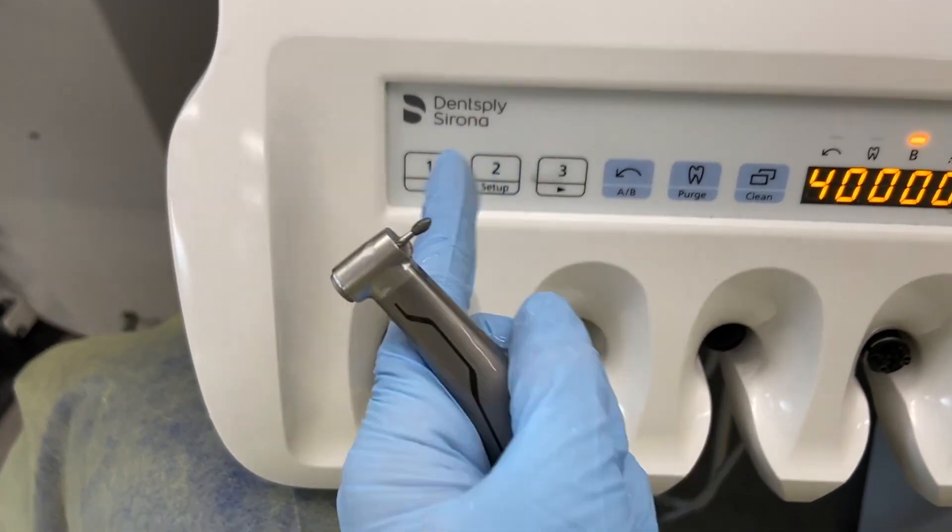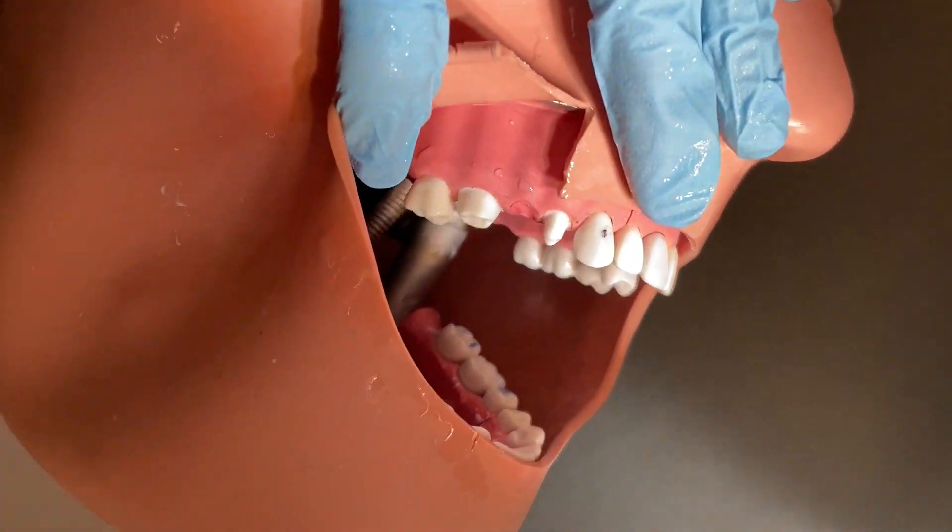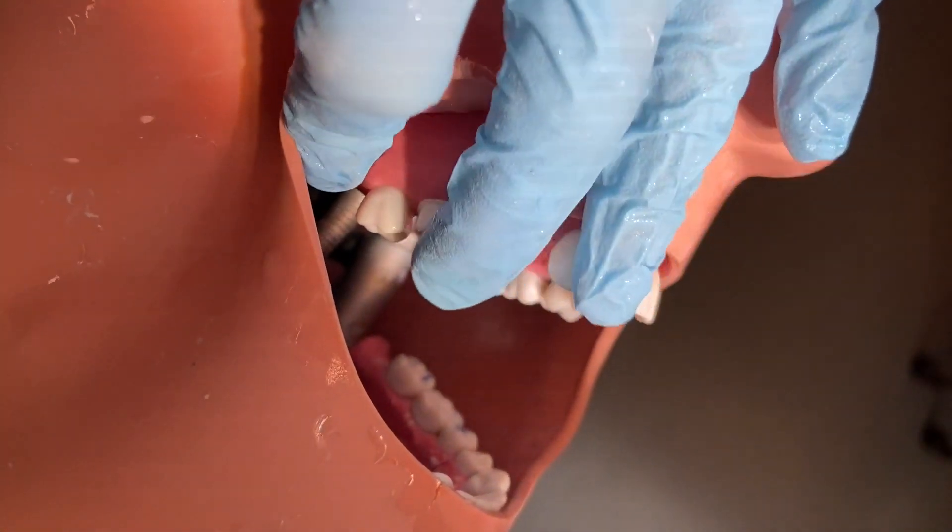Here I'm showing our handpieces — they're actually electric, which is very nice. And here I go — my ugly prep.